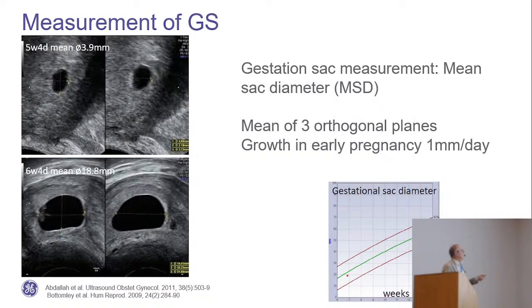And so you have the three planes, you have these two images, and then you measure. And I think we all did it like this, that you have a probe, you hold the probe like this, make one image in dual screen, and you hold the probe like this. But now we all learned how to make a 3D. So why not make a 3D and then scroll to the different planes? Because now we all know which plane you have, A plane and the B plane.